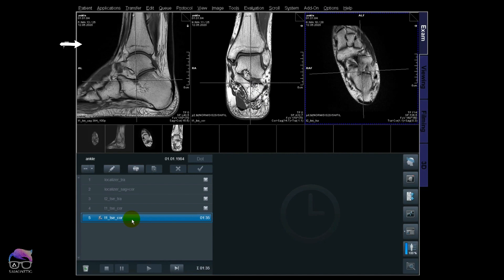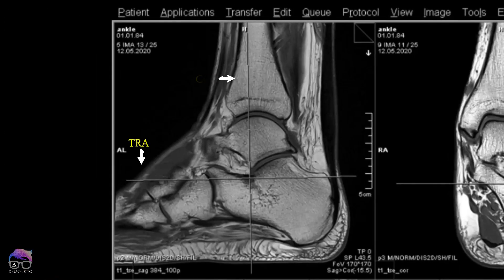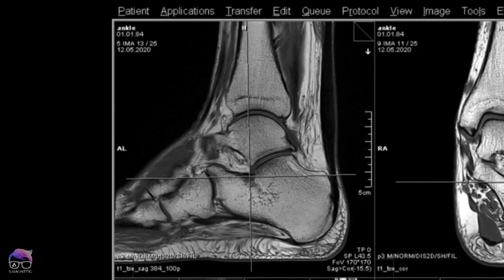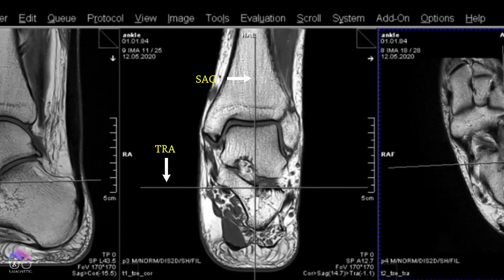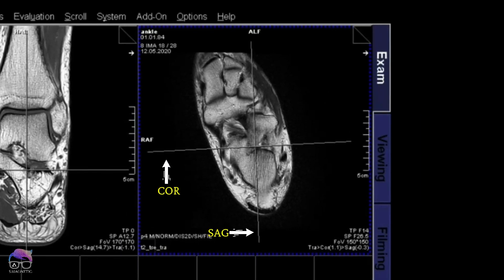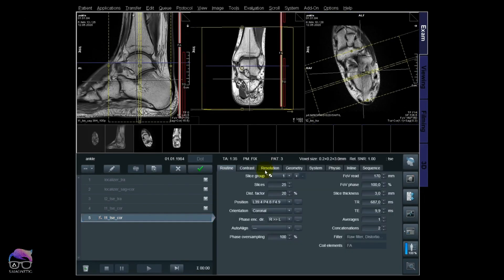Let's check the images. I already did a scan to save time: a T1 sagittal there, a middle coronal T1, and then transversal. You can see the reference lines, which makes it easier to understand this perpendicular tool. Take a closer look at the sagittal — you have lines there and there. On the coronal you have a line there and there, and the same for transversal — there and there.